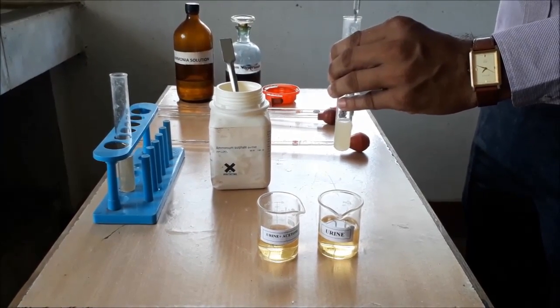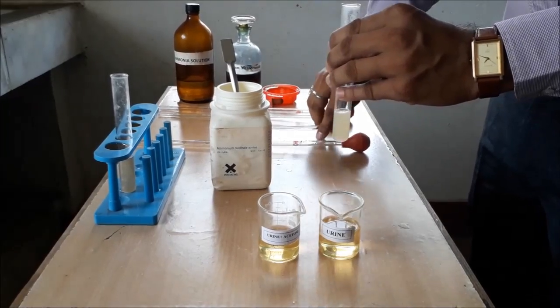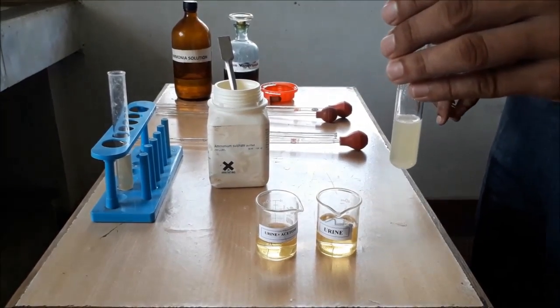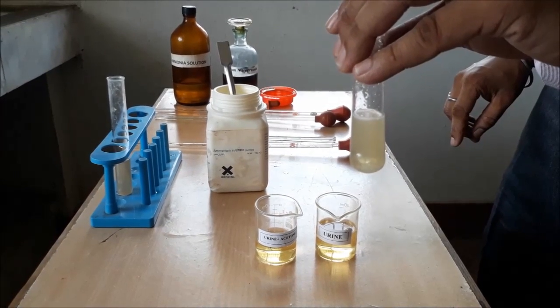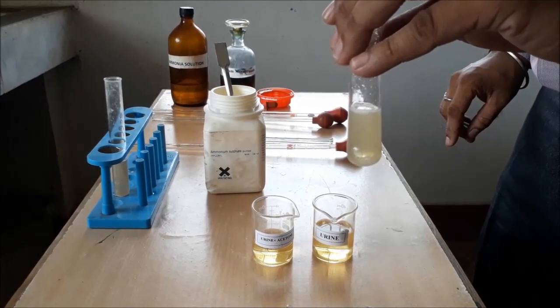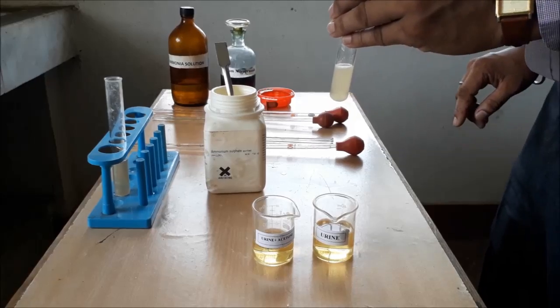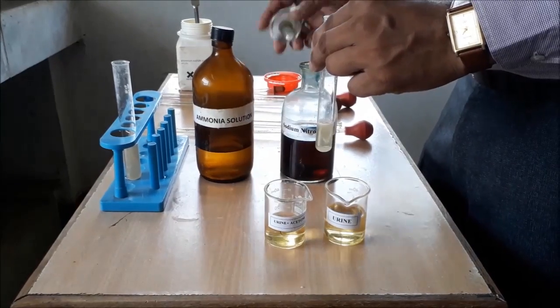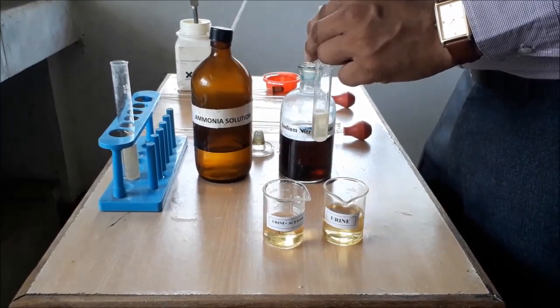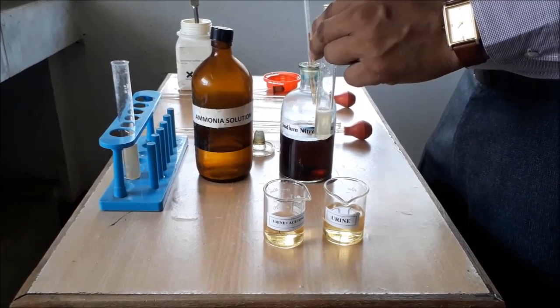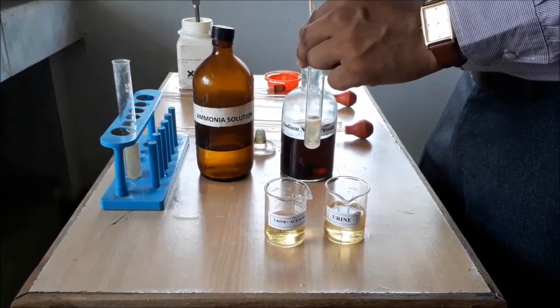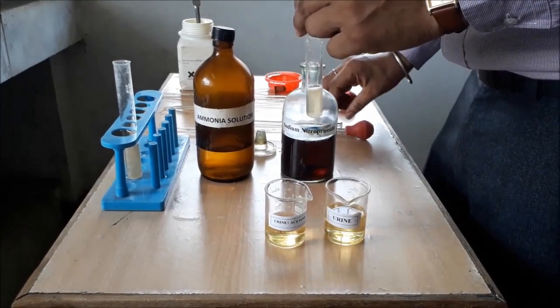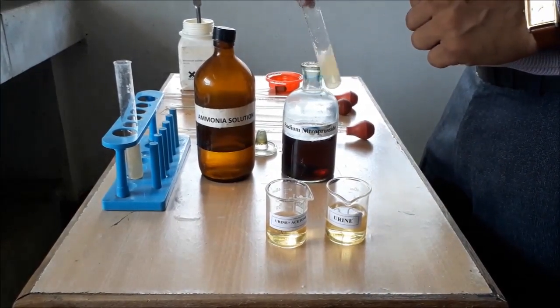We have mixed it thoroughly. And we are about to see that there is a presence of undissolved crystals of ammonium sulphate. Now, we are adding two drops of sodium nitroprusside on the sample.